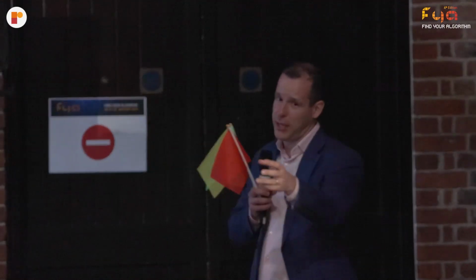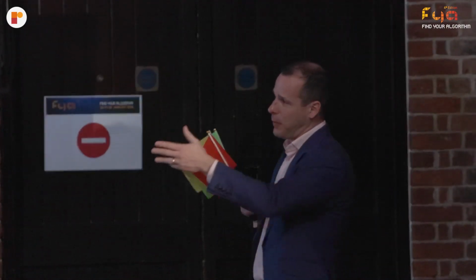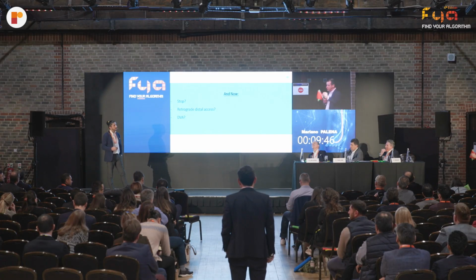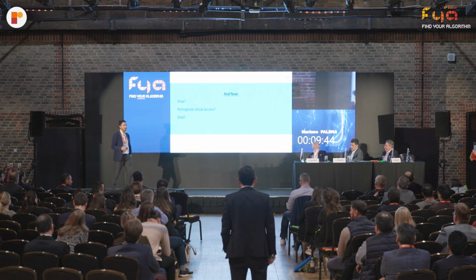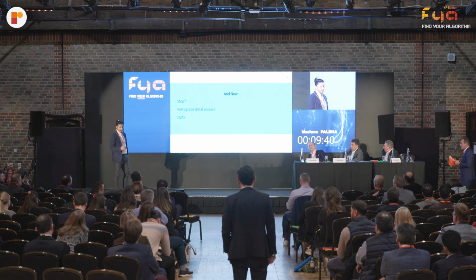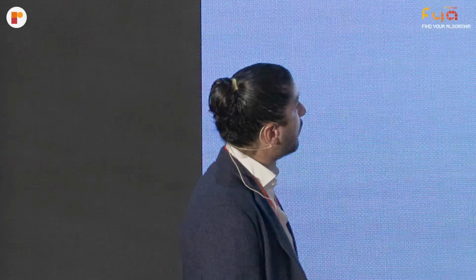Just saying that if you want to do that, you need to pump the right amount of contrast in the peroneal. Yeah. You pump like in the popliteal 10 milliliters of neat contrast in order to see that potential target. It's very important to be selective and to pump the right amount of contrast. Yeah, fully agree. So let's show what I did.